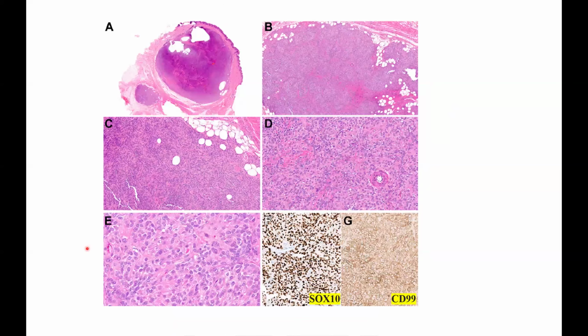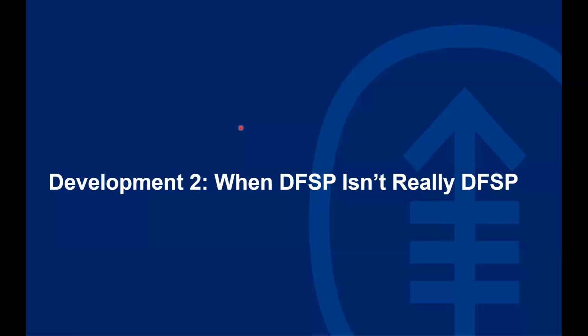And again, another case. So it seems that a superficial tumor with EWSR1-FLI1 or FET-ETS fusion, with or without diffuse membranous CD99 positivity, that is diffusely positive for S100 and SOX10 may not actually represent a genuine, bona fide Ewing sarcoma, but a distinct entity with a much more indolent behavior.